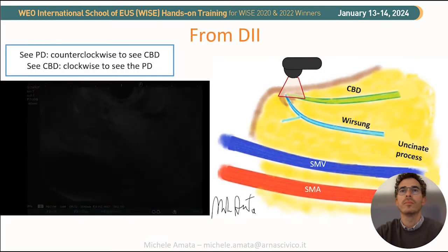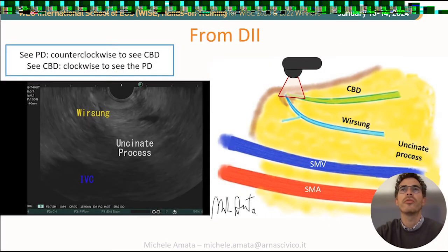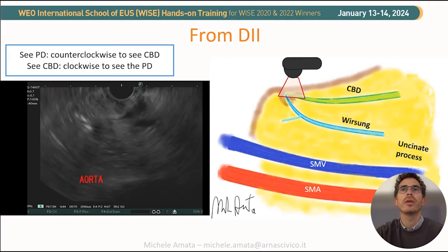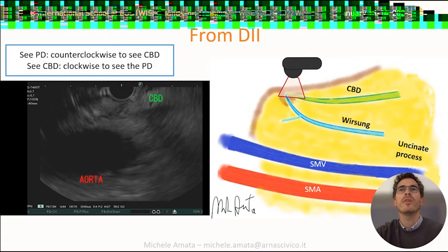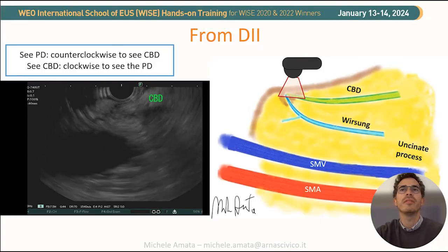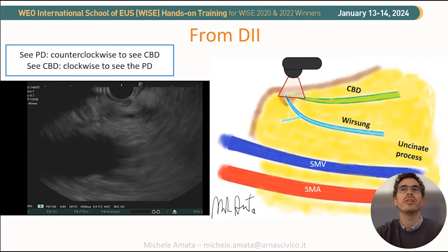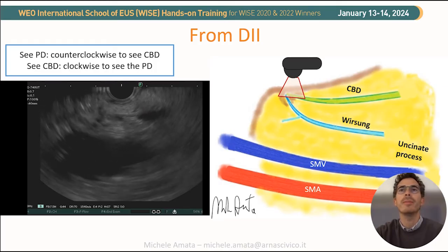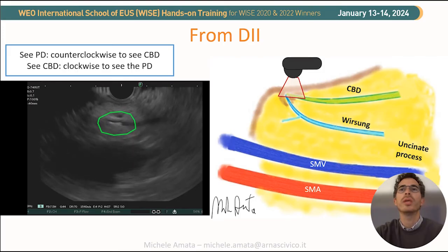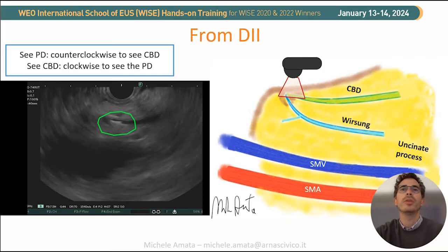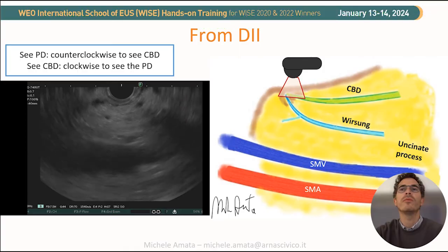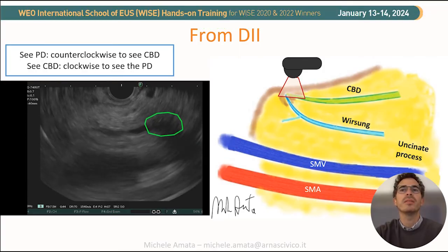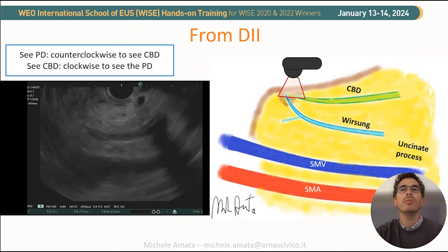Similarly, in this clinical case we interrogate the uncinate process and trace the Wirsung coming into the papilla. Moving counterclockwise, we see the CBD, and avoiding too much pressure on the tip, it was possible to see hyperechoic images with shadowing inside the CBD, compatible with stones. Continuing the withdrawal, we evaluate the entire bile duct system, also in the medium and proximal portion of the biliary tree.